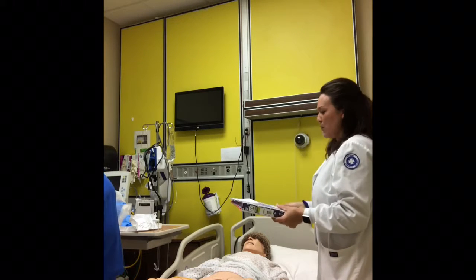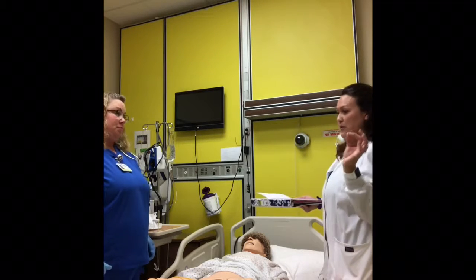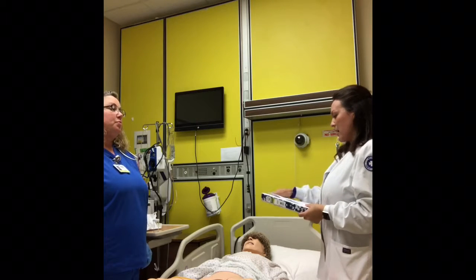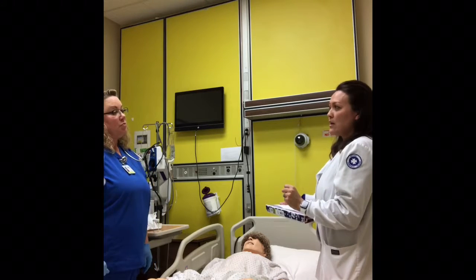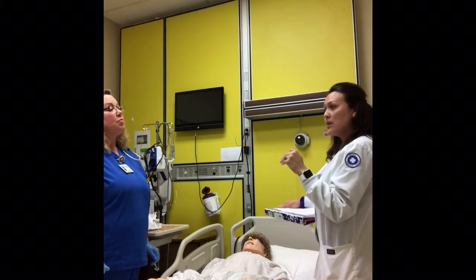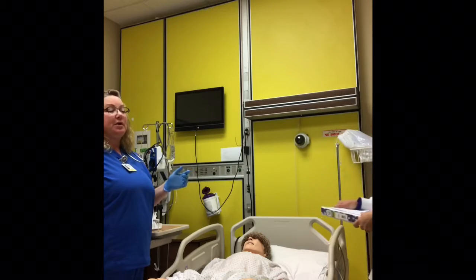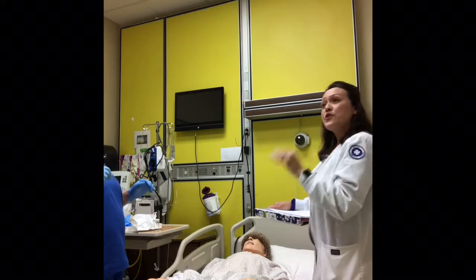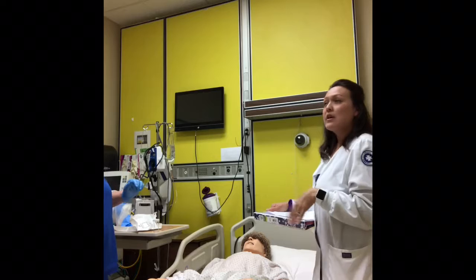And then another thing I want to note, Amber, for male patients, all the steps are the same for sterility, and the concepts are still the same. But with male patients, when you grab the shaft of the penis, it's important to keep the penis at a 90-degree angle towards the patient because the catheter insertion goes a little bit more easily with that position. In that position, I found that you don't have as much resistance from the prostate. And if you do have some resistance, or the male patient is telling you that it hurts a lot, you need to stop.